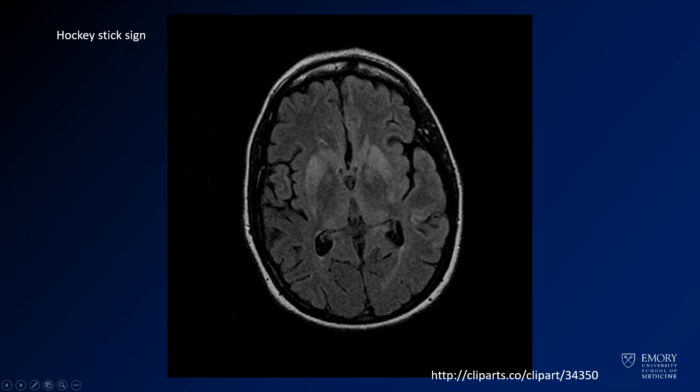Here you see the axial FLAIR-weighted images. Again, you see the T2 or FLAIR abnormalities in the same areas. You also have T2 hyper-intensity in the pulvinar nucleus of the thalamus, and then also the medial aspect of the thalamus. The reason you call that the hockey stick is because the abnormality in the thalamus is shaped like a hockey stick.